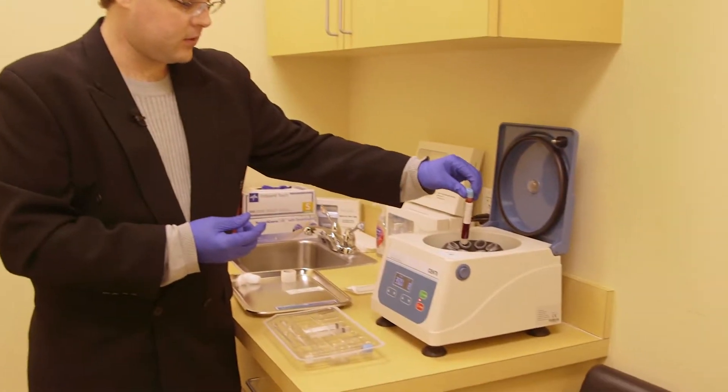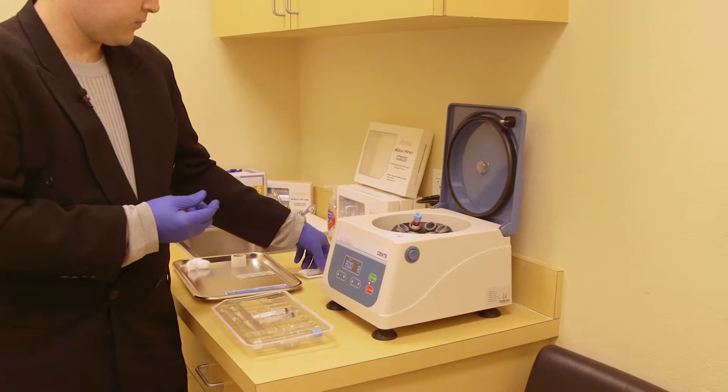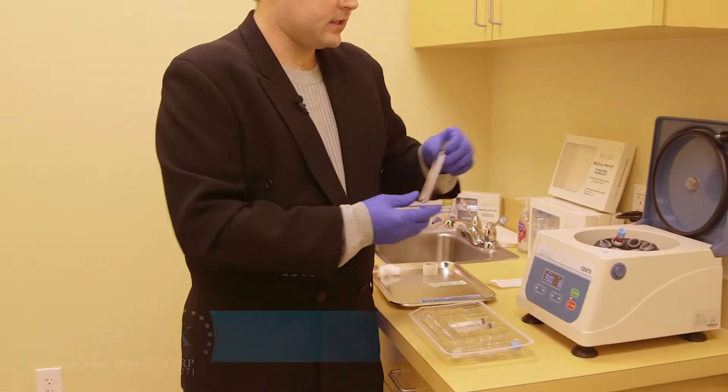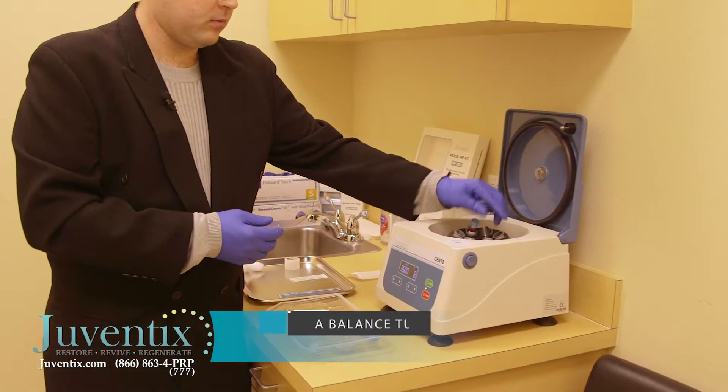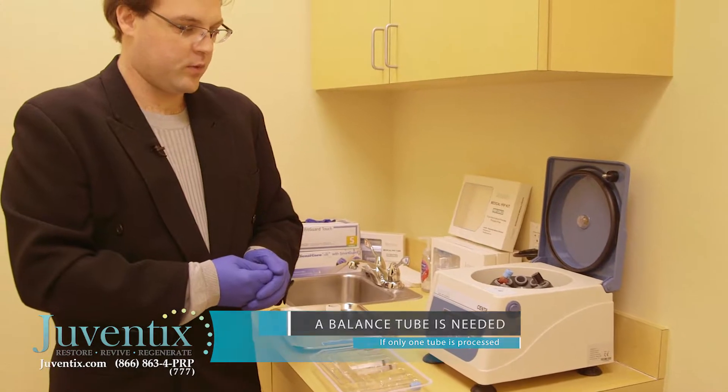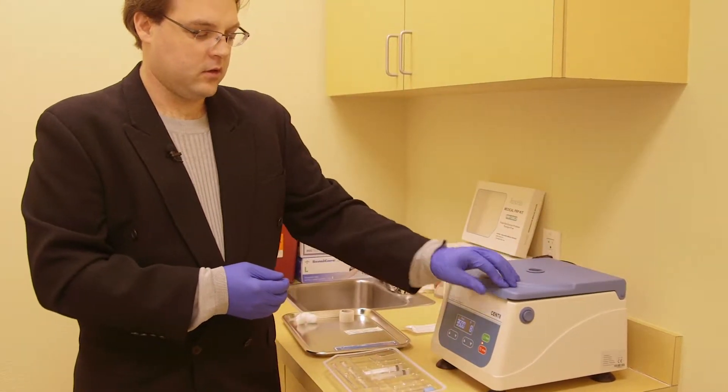Then we're going to place it into our centrifuge. We're going to take our balancing tube that we prepared earlier and place it directly across from the blood tube. This will balance the product during the centrifugation process. We're now going to process the blood for eight minutes at 3500 rpm.